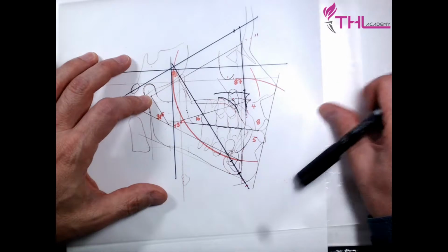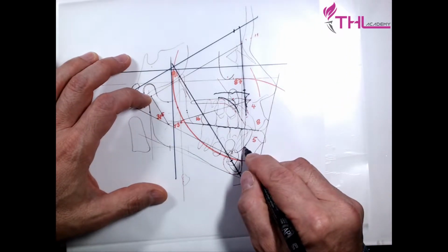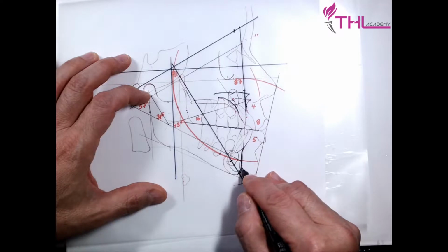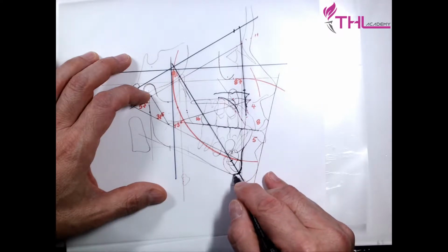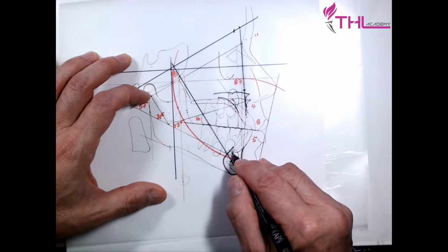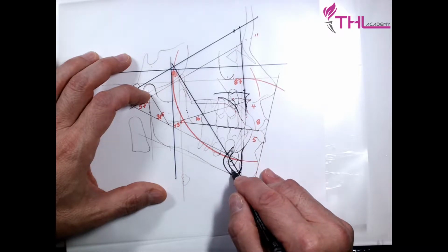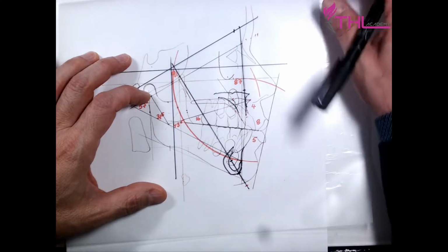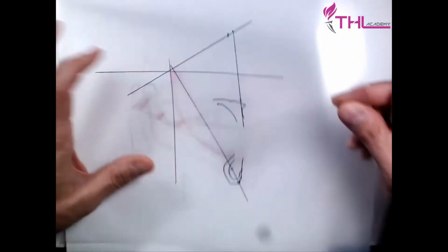And then in this new point, I draw the new chin, at the new nasal plane point. 1.2 for point A going down, 2.5 for the chin going down.